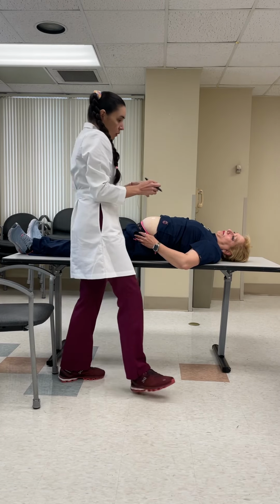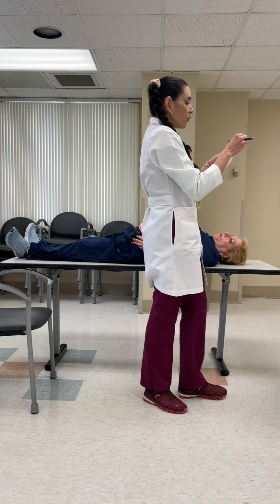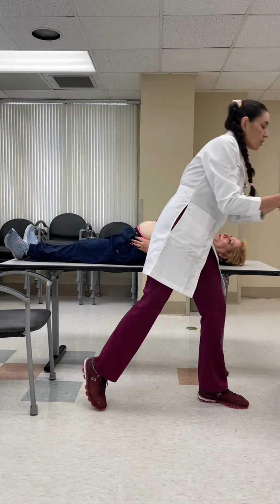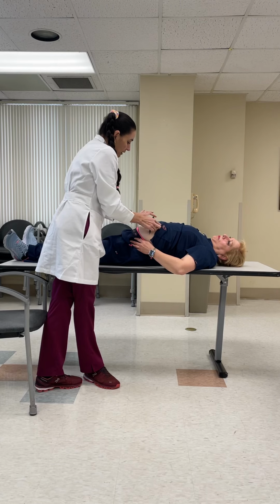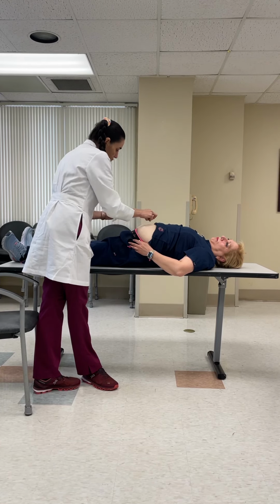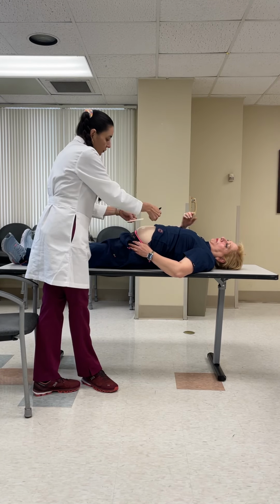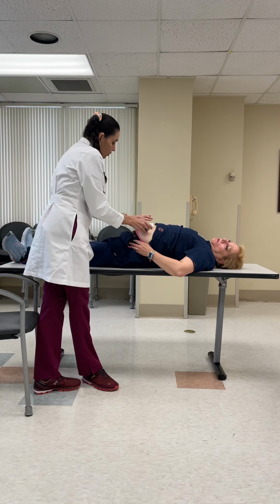So now that we have her lying down, we can also do it with the disc. The reason we also need the disc is to make sure that the edges are not touching the umbilicus. In that case, I think it can be a little lower, because we don't want these borders touching surfaces like the umbilicus and folds. Like this one would be a good location.